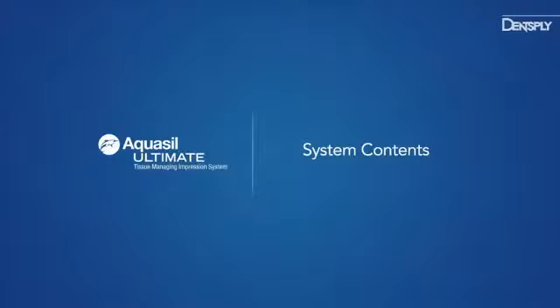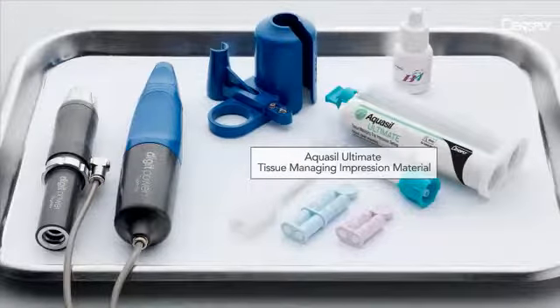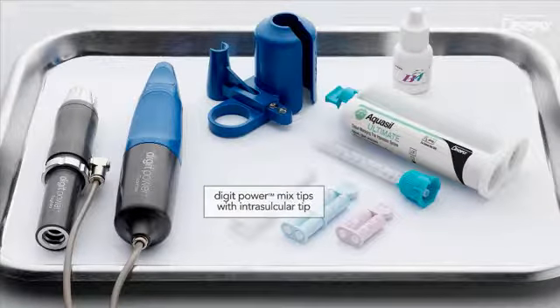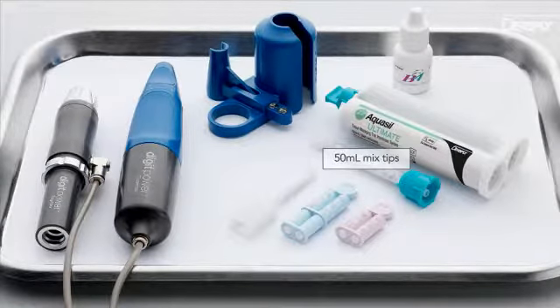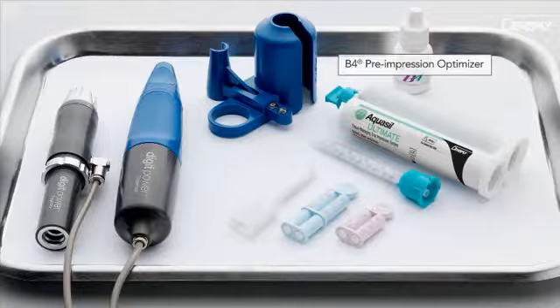New Aquasil Ultimate is the first retractionless tissue managing impression system. It includes the DigitPower Dispenser, Aquasil Ultimate Tissue Managing Impression Material in both single and multi-unit formats, Aquasil Ultimate Tissue Managing Tray Impression Material, DigitPower Mix Tips with Intrasulcular Tip, 50ml Mix Tips, and B4 Pre-Impression Optimizer.